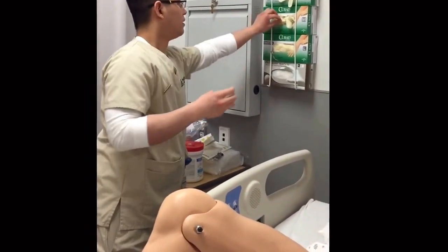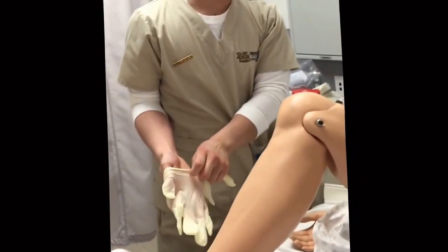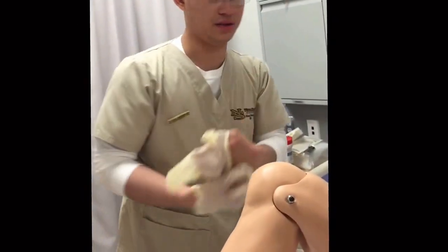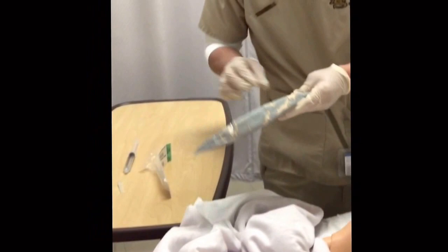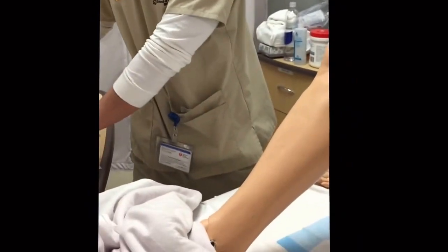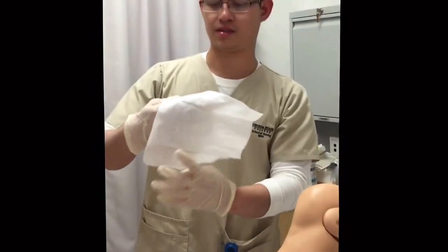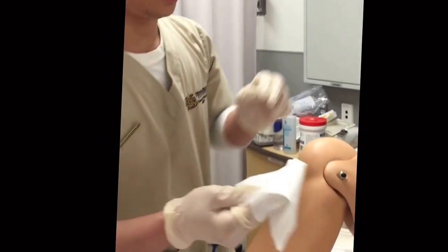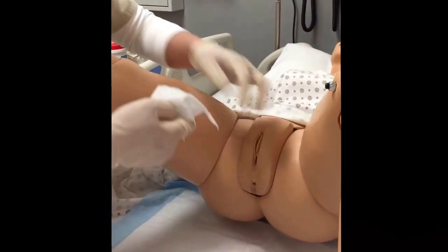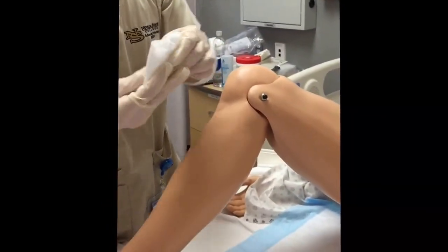Alright, I'm just gonna double check your wristband. So Miss Susan, I'm just gonna do perineal care on you before I leave, okay? Just to make sure that there's no discharge or any secretion on your private area, okay? So just make sure that you do this. Just one wipe on each side. If you have a towel, you can use a towel, but you can go ahead and just clean it. It might be a little cold, okay? So just clean it, and then you can go ahead and use the other side, just to make sure that you're wiping and no lube or any discharge is left on her.